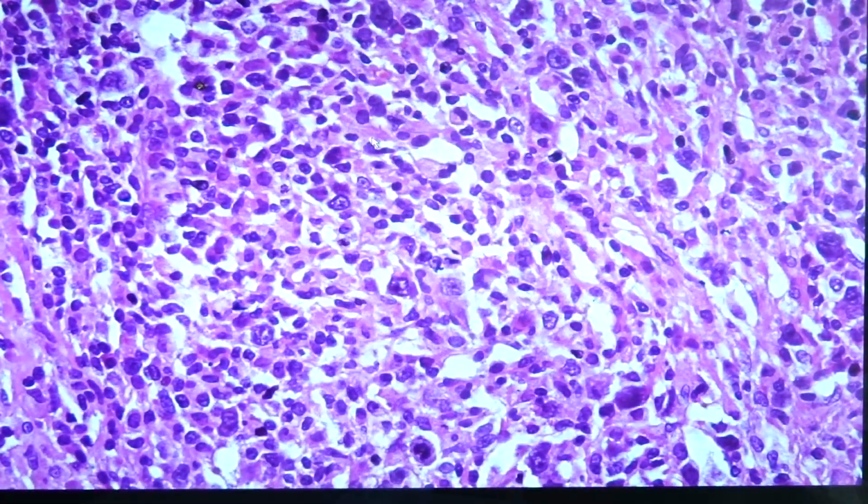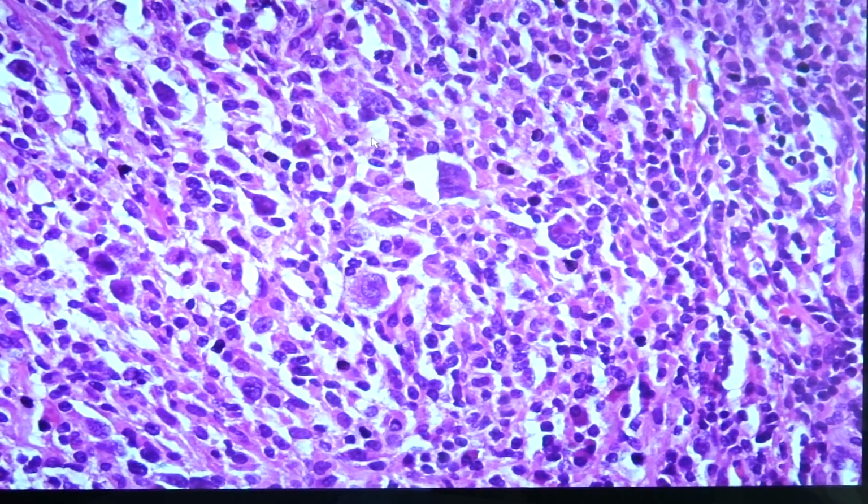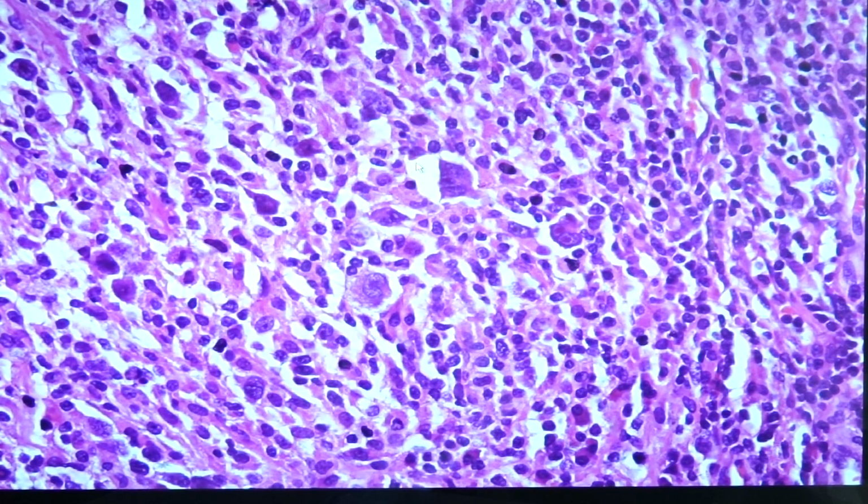Let's try to look for a lacunar cell. Okay, this one. So it is a lacunar cell. So a lacunar cell would be Reed-Sternberg cells that would show the typical appearance, okay, having multinucleation, and it is found within an empty space like this one, so like a lacuna. So that's why they are called lacunar cells.